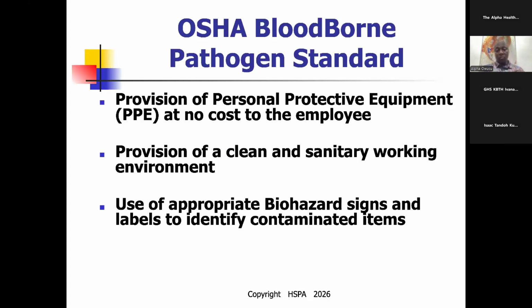Last week, one of my participants asked me, how should the mode of transport be? When we are carrying soiled items, it has to always have a biohazard sign so that the person approaching you knows that what you are carrying is biohazard. The same way, when we are sending clean and sterile items, it should also be indicated, clean or sterile. Very, very important. This should be done and labeled so that they are identified as contaminated.